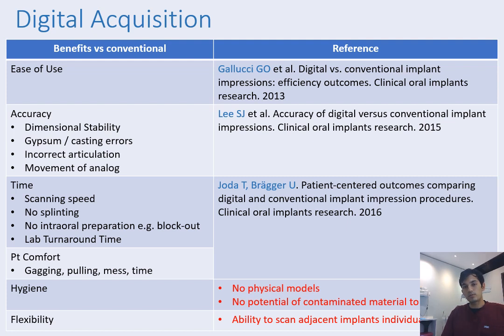When taking a conventional impression, you have to block out any excessive undercuts. If it's a case with recession, you have to close those interproximal spaces with wax or some other method. Patients with large tori where it's difficult to seat a tray. Again, these are factors that don't exist in digital. You can scan the entire case regardless of undercuts or mobile teeth for that matter.